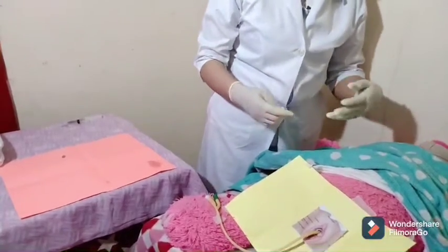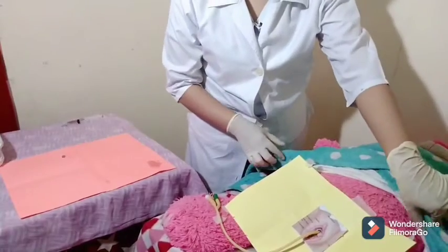Place the client in a comfortable position. Do aftercare of the equipment used. Remove gloves and do hand washing. I'm done now, and I'm going to place you in a comfortable position.